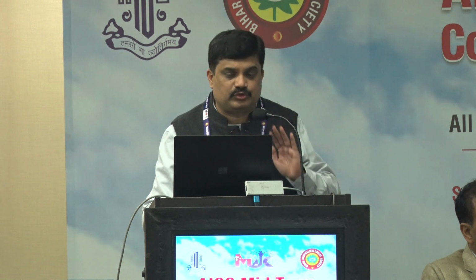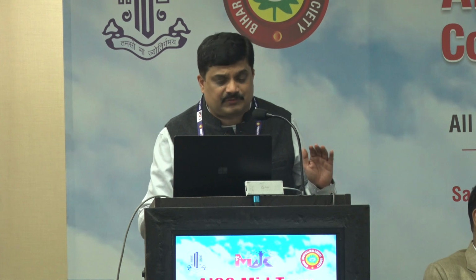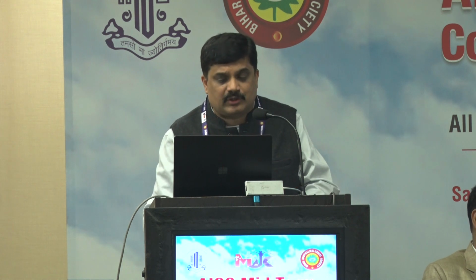So coming to the keratometry, basically it is used to measure the corneal curvature. We have to do it before axial length measurement. There are two types of keratometer. One is manual keratometer, auto keratometer, and also with the help of topography, either with the placido disc or elevation based, you can know the keratometry.